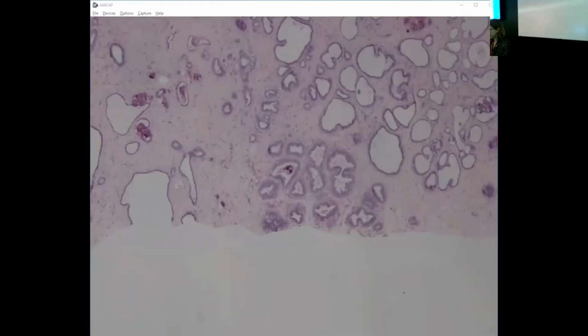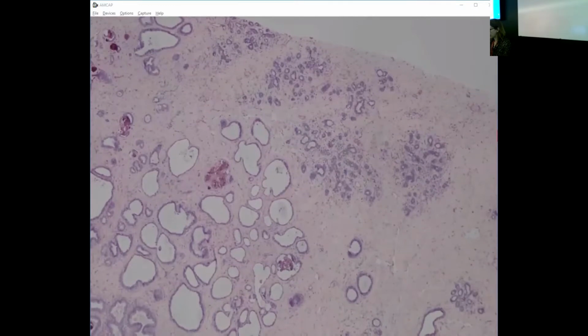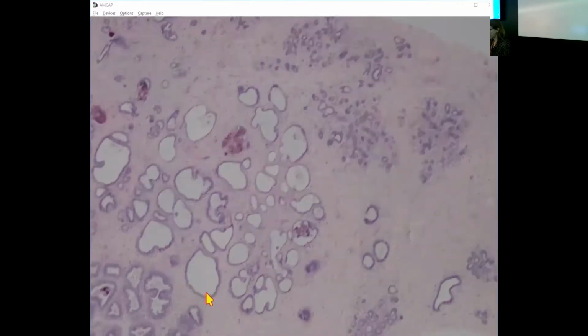Okay, so this is a 52-year-old with image detected microcalcifications. And it's just a very nice illustration of a columnar cell lesion, right? First of all, you see the calcifications here and the variable dilatation of the acini of the terminal duct lobular units.